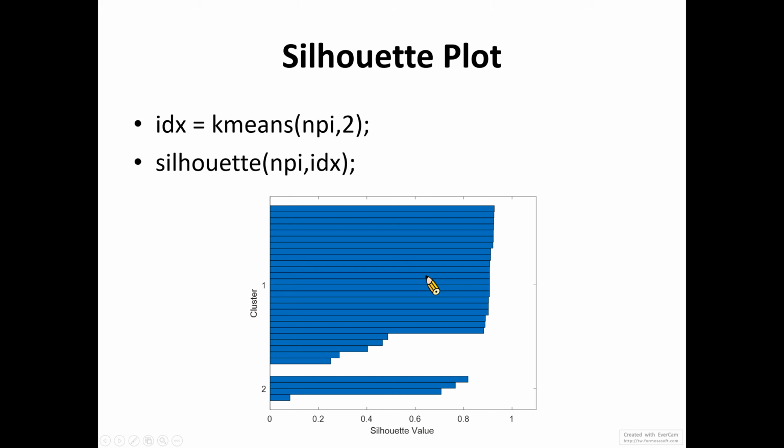I would say that if you have lots of dementia cases, you will be able to see real clusters. But because we have only 30 cases now, I just want you to have some insights into how this is working and to develop ideas on your own data.